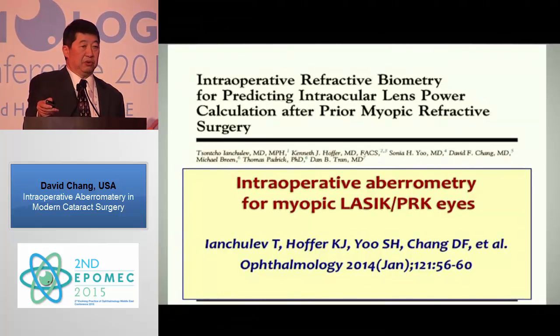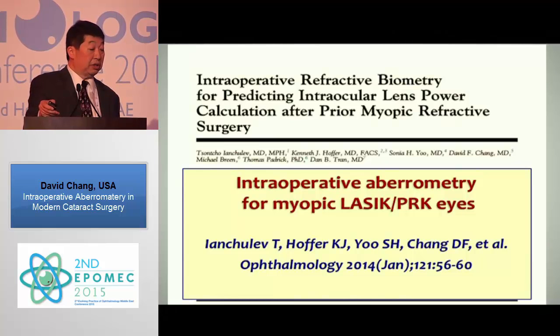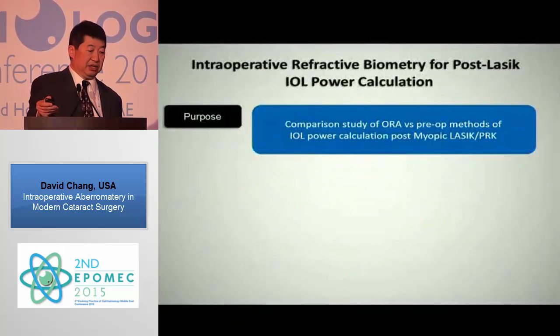So this, of course, is our real big challenge for all of us, and that's selecting the IOL power in post-LASIK PRK eyes. I was a co-author on this study that came out in January of last year. It's really the first and only study that looked at intraoperative aberrometry in this group.